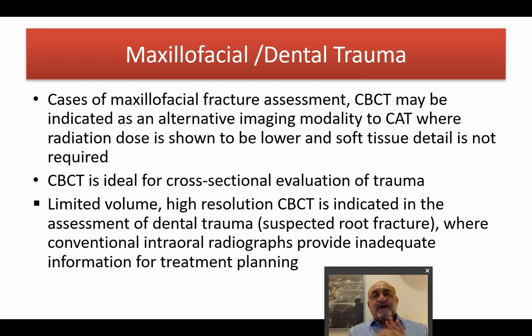So whether you have a fractured tooth or a fractured alveolus or fractured bone, two-dimensional radiographs might hide the fracture lines, the radiolucent fracture lines, especially if they are tiny or small.